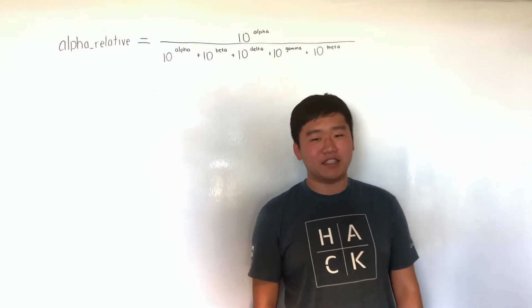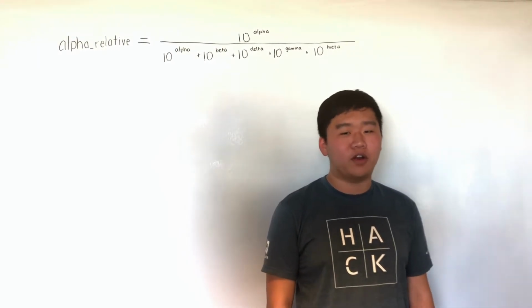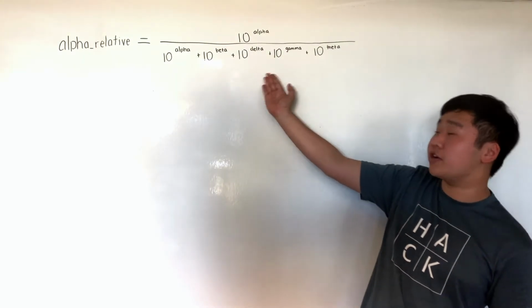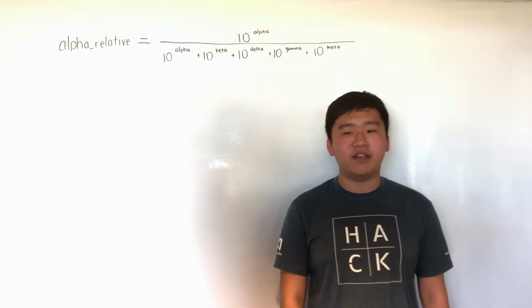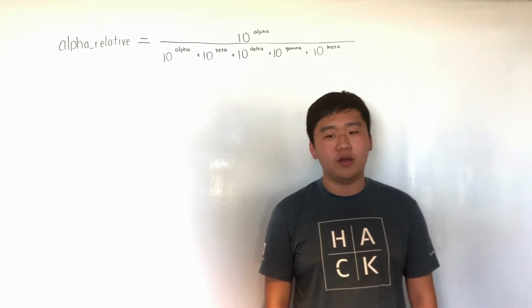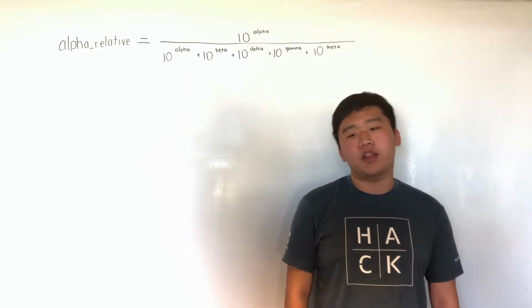For the alpha wave processing, we take the average of the 4 recorded relative alpha values, which is the proportion of alpha waves in the EEG signal. We take this average and compare it to the predetermined alpha threshold. If the average is larger than the threshold, we update the LED status to on, otherwise we update the status to off.